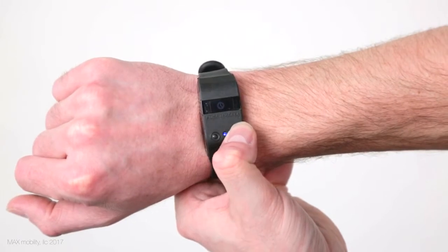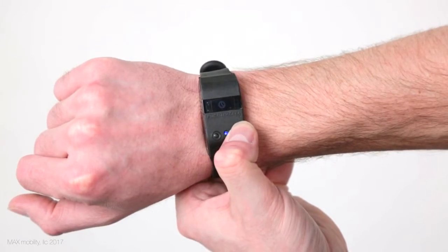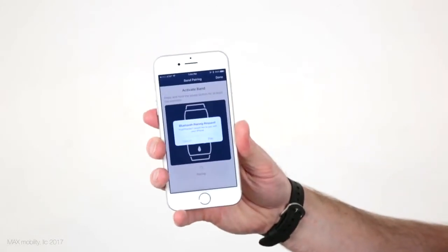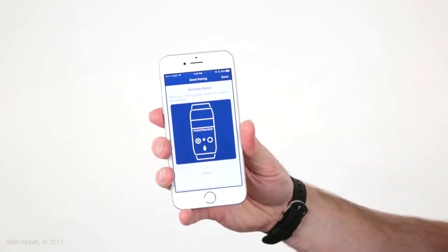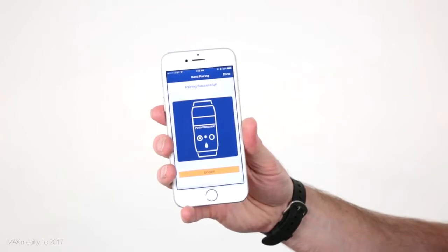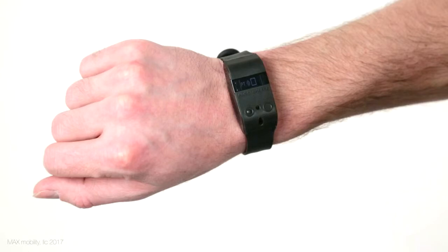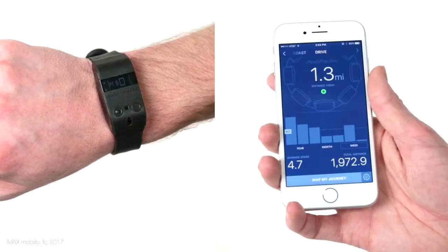You can manually enter or change the time and date on the PushTracker. But for simplicity and accuracy, connect to the PushTracker app and it automatically uses the time from your smartphone. Here, you can also switch between 12 and 24-hour display. For your PushTracker to be able to communicate with the app, you will need to do an initial pairing of the PushTracker to your smartphone or other device through this PT Bluetooth app pairing screen.